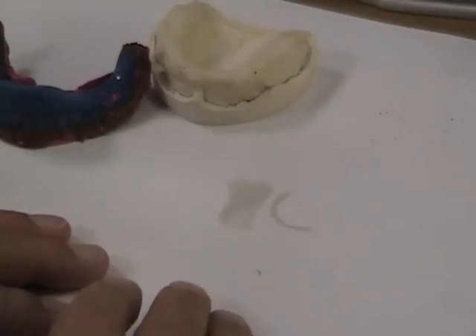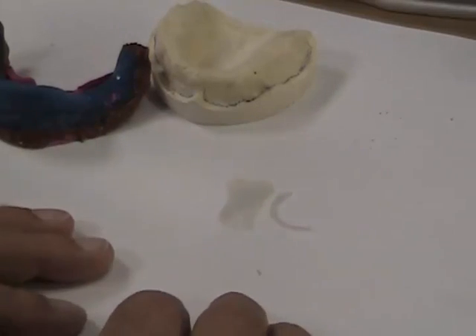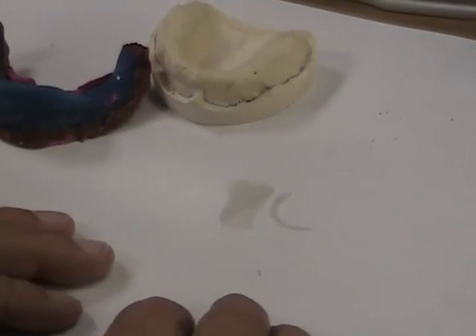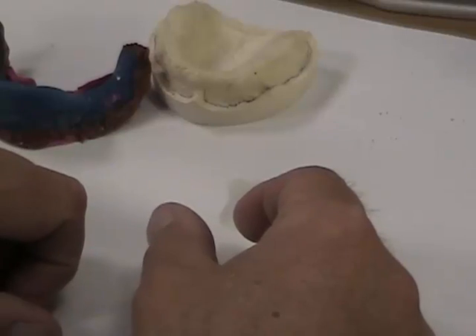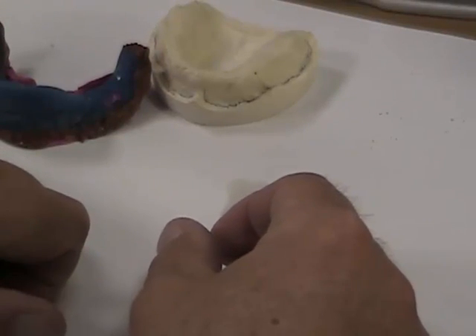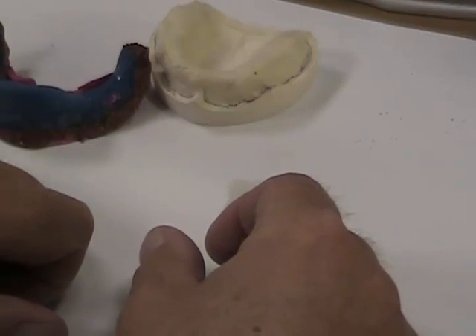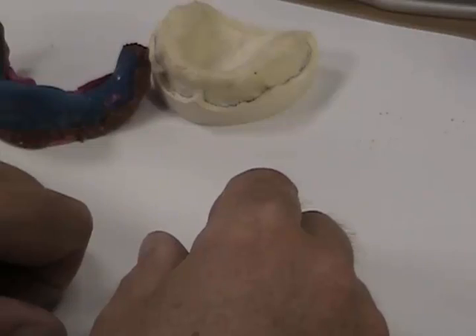I thought I'd take today and use an impression that came in the office to illustrate a deficient technique. I know it's because they don't understand what custom tray fabrication does and how custom tray fabrication works, so I thought I'd just go back and highlight the points of a custom tray real quick.